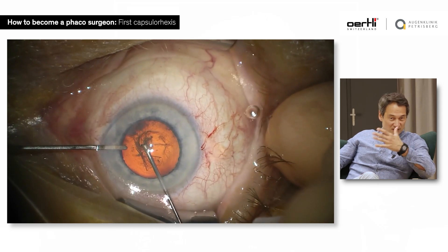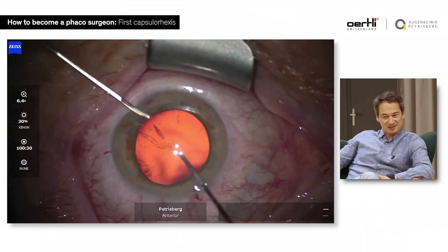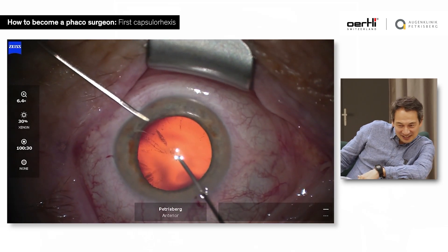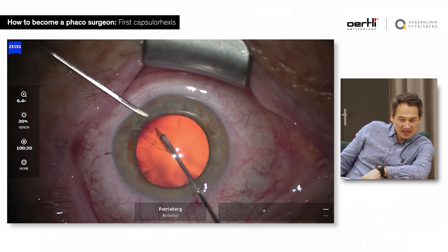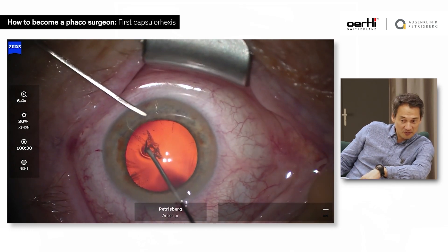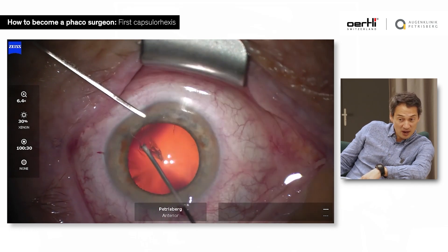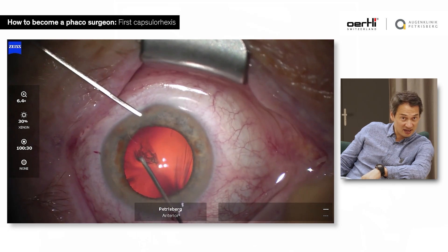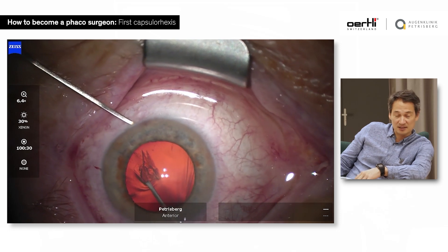Once you have a bad capsulorrhexis, your surgery is probably going downhill very quickly. It's very important to just do it properly. What you see there also is you have the left hand inside the eye to support it, and I always make it a point to have two hands and two instruments inside the eye.